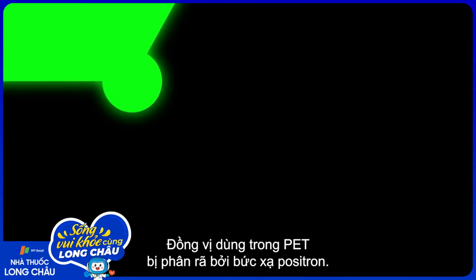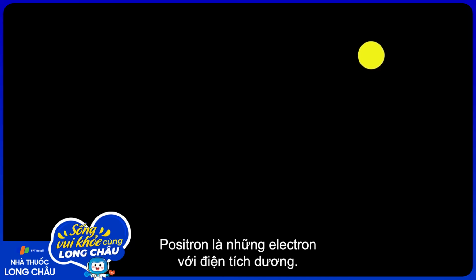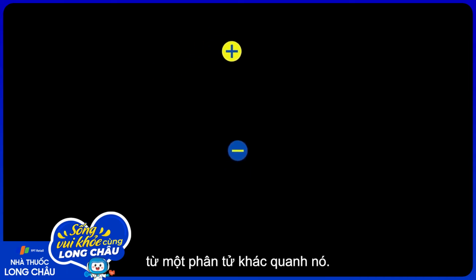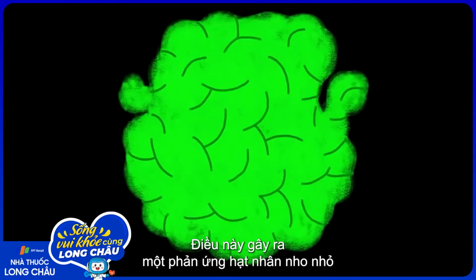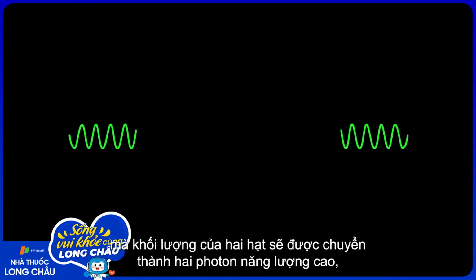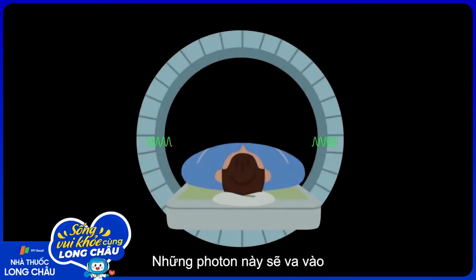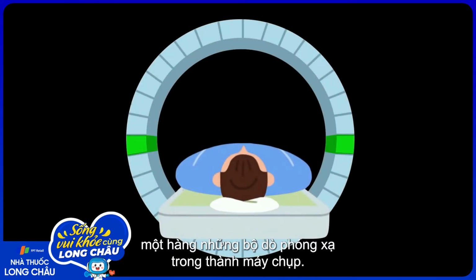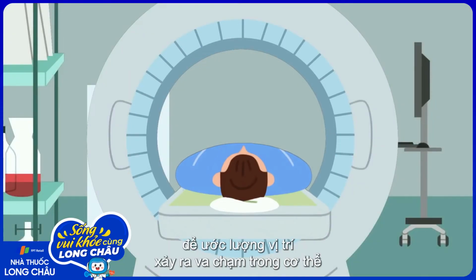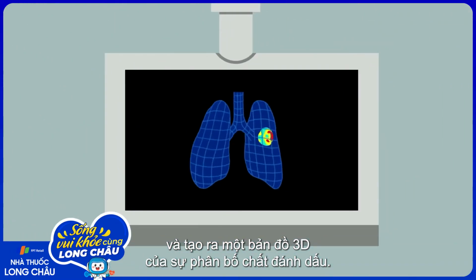The isotopes used in PET decay by positron emission. Positrons are essentially electrons with positive charge. When emitted, a positron collides with an electron from another molecule in its surroundings. This causes a tiny nuclear reaction in which the mass of the two particles is converted into two high-energy photons, similar to X-rays, that shoot out in opposite directions. These photons will then impact an array of paired radiation detectors in the scanner walls. The software in the scanner uses those detectors to estimate where inside the body the collision occurred and create a 3D map of the tracer's distribution.